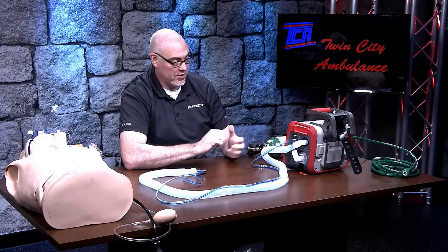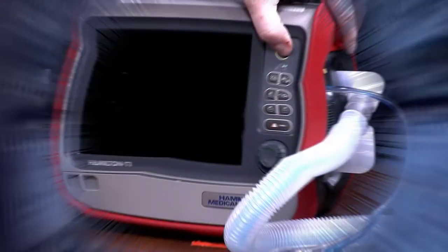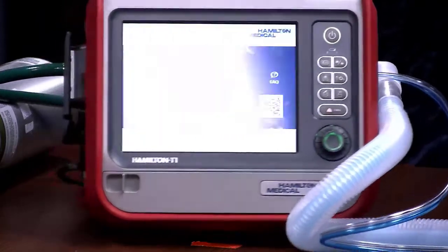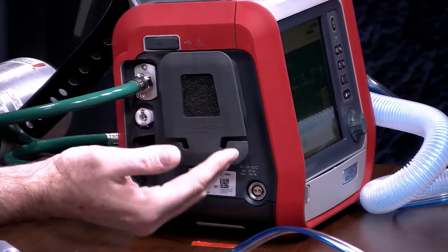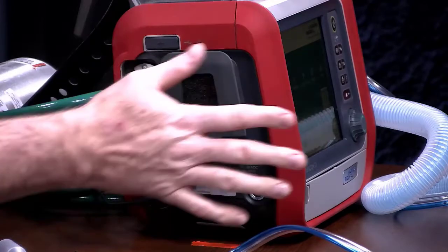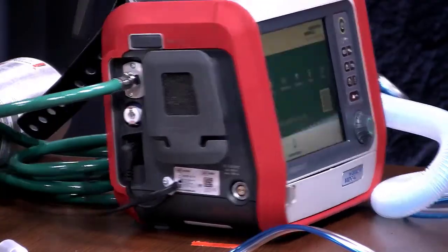At this point, the connections are pretty much set to go for your patient. The next thing we will do is turn the ventilator on and go through the setup to ensure the connections are correct. When you first turn on the monitor, it's going to go through a setup cycle as most computers do. On this end of the monitor, there is an air intake — a piece of sponge where the air is drawn in from atmospheric air to produce the pressure to run the vent. When you have this with your patient, make sure this is unencumbered and not blocked, because you'll actually be blocking the intake air going into the ventilator.